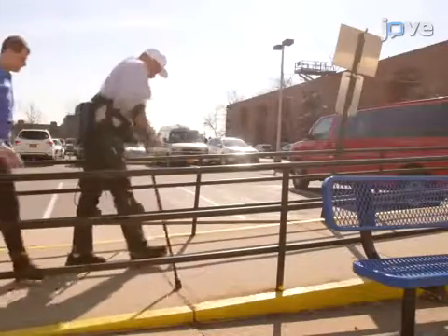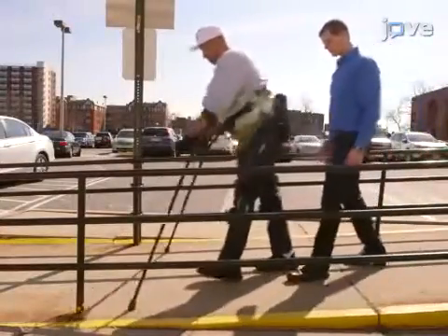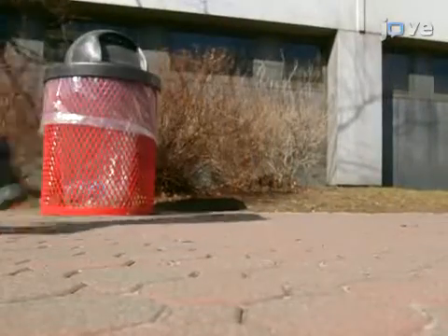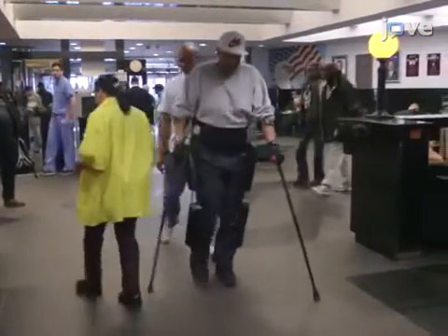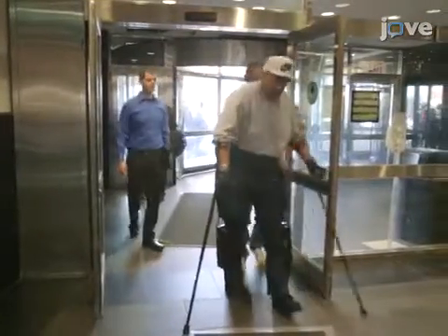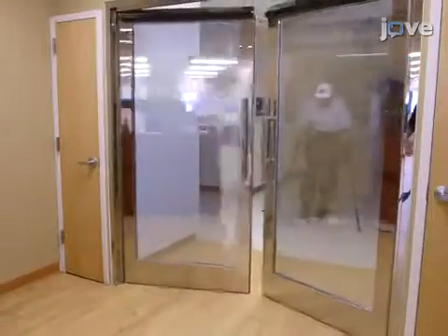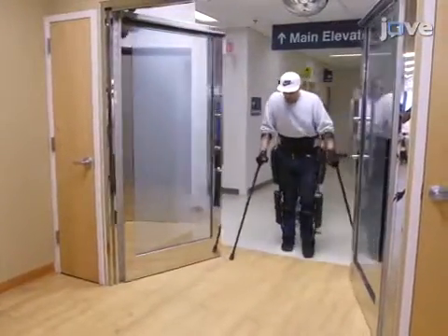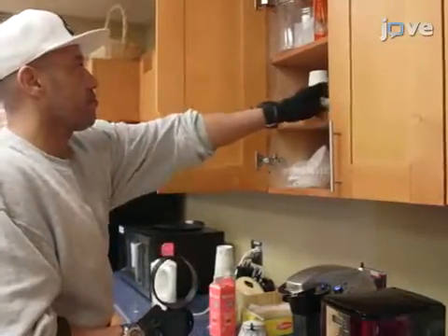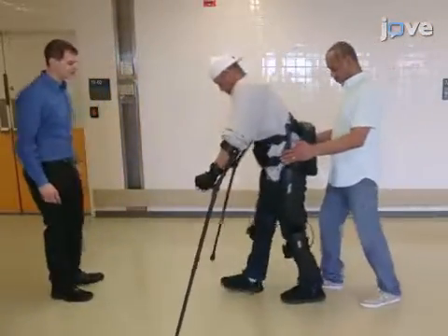Ask the participant to walk on surfaces with varying slopes, such as up a ramp, down a ramp, across a curb cutout, and on uneven surfaces. Have the participant walk in a noisy environment, such as a hallway with other pedestrians. Practice navigation of doorway thresholds, opening and closing doors, and walking through automatic doors. Incorporate additional activities such as reaching overhead into a cabinet or sitting on and standing up from a bench. Finally, have the participant practice stopping on command or at will.